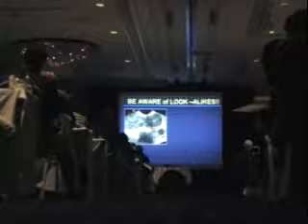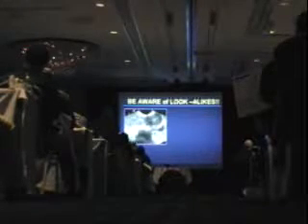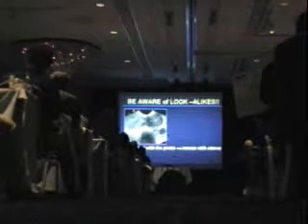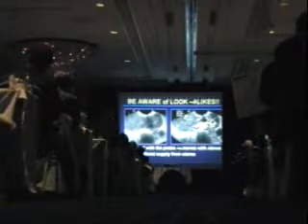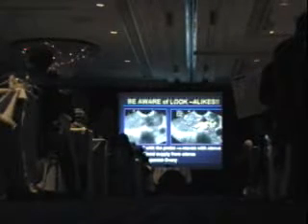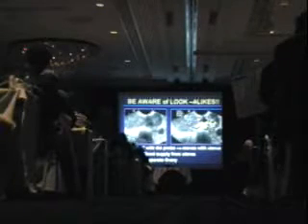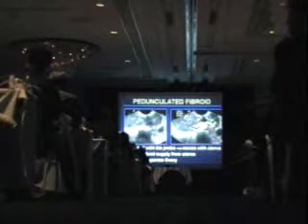Be careful, there may be lookalikes. That could be an ovarian fibroma, certainly, but maybe it could be a pedunculated fibroid. Well, maybe. By pushing again, that tends to move with the uterus. Another maneuver that I like to do is put blood flow on and see if it's supplied from the uterus, which I think it is in this case. You can see those vessels. And find the other ovary in another location. So then this is going to be just a pedunculated fibroid. So there are things that can mimic masses that you think are the ovary, but are not.